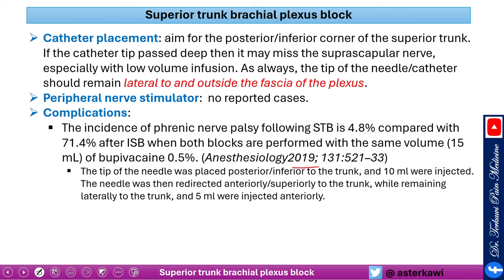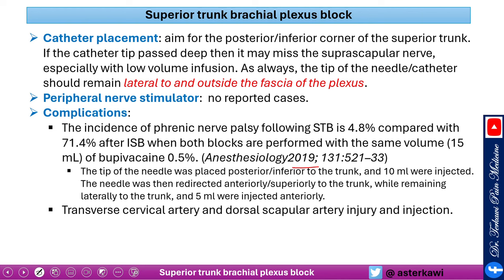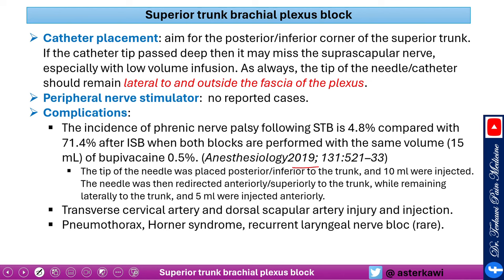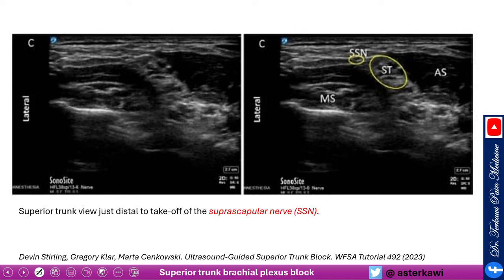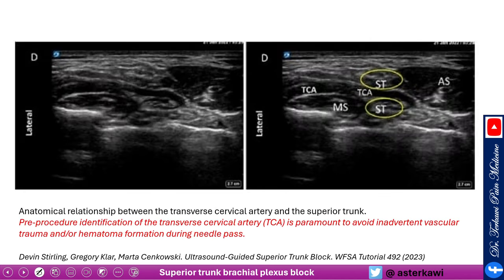The superior trunk technique from the original paper: place the tip posterior and inferior to the trunk and inject about 10 ml, confirming a nice spread. Then withdraw and redirect anterior and superior and inject 5 ml to capture the suprascapular nerve, which is always lateral and superficial to the superior trunk. Other potential complications include vascular injury from the transverse cervical or dorsal scapular arteries — which is why Doppler identification is essential — as well as rare pneumothorax, Horner syndrome, recurrent laryngeal nerve effects, and LAST.